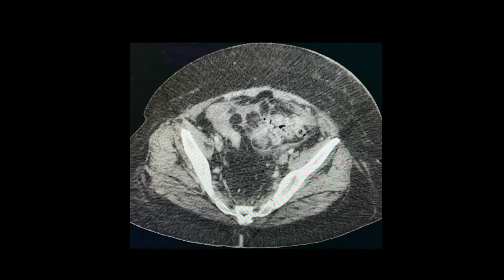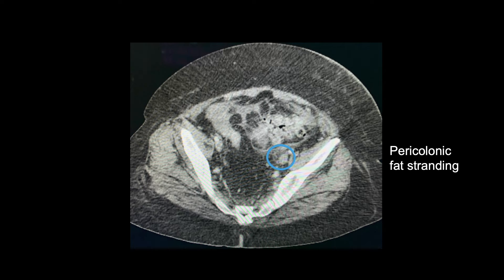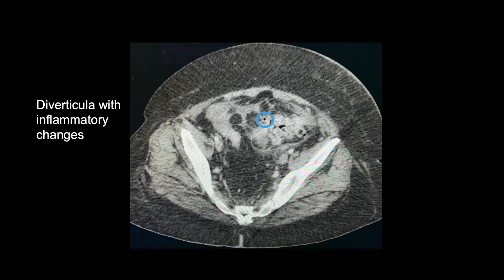CT findings suggestive of acute diverticulitis include the presence of localized bowel wall thickening greater than 4 mm, an increase in soft tissue density within the pericolonic fat secondary to inflammation or fat stranding, and the presence of colonic diverticula with inflammatory changes, like that seen in this axial CT slice.